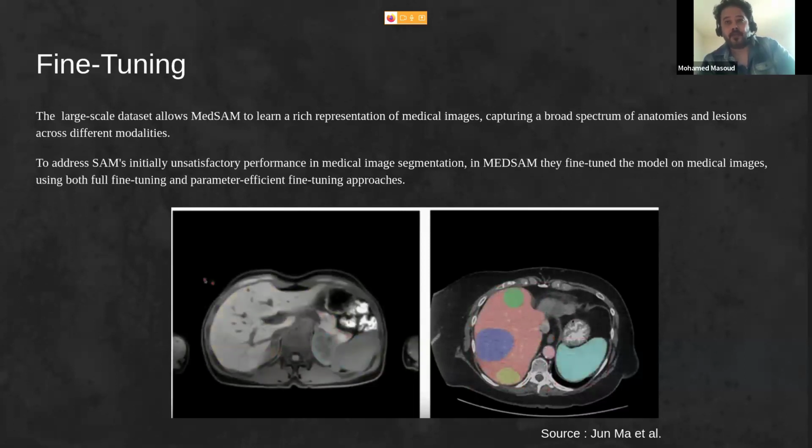They trained the model on text captions, so you can prompt with text, and you can also use the bounding box like we can see here in the example. I think there are 3 different GitHub or Colab notebooks available to show all the results we see here: one for text, one for bounding boxes, and I guess one for points, where you click only a point on a certain part and it gets the object in that area.